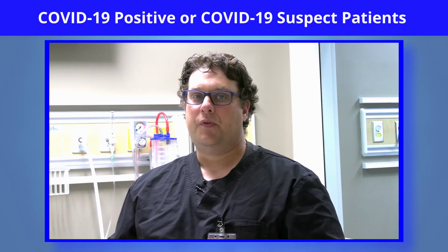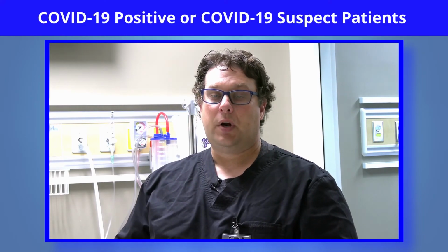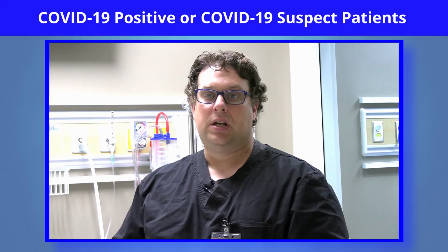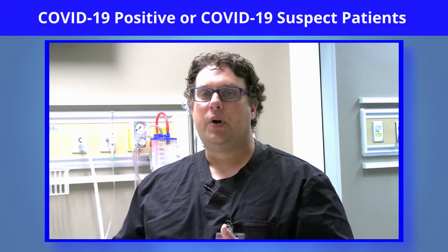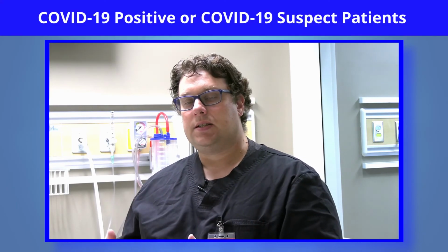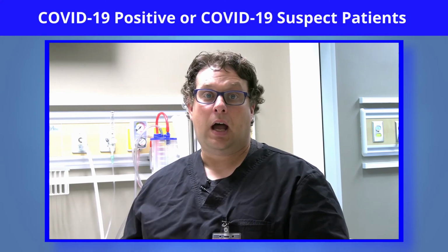So the last thing we need to talk about with high flow therapy is applying high flow therapy to your COVID suspect or COVID positive patient. So ideally you want to do high flow therapy in a negative pressure room if you have that available. If not, a private room with the door closed is a safe option as well. If you look at some of the recommendations, high flow itself is not necessarily an aerosol generating medical procedure, but it is potentially the patient coughing or the way they're breathing that could be producing aerosols that could potentially be carrying a high viral load.